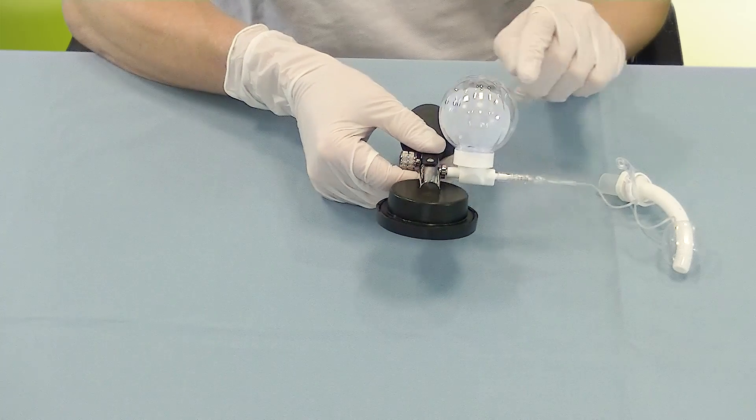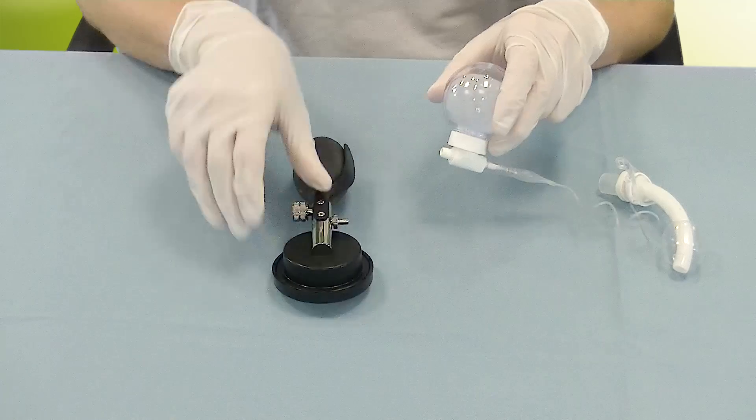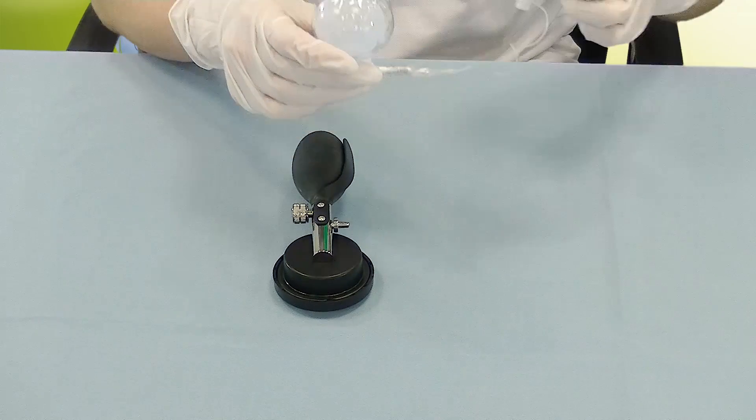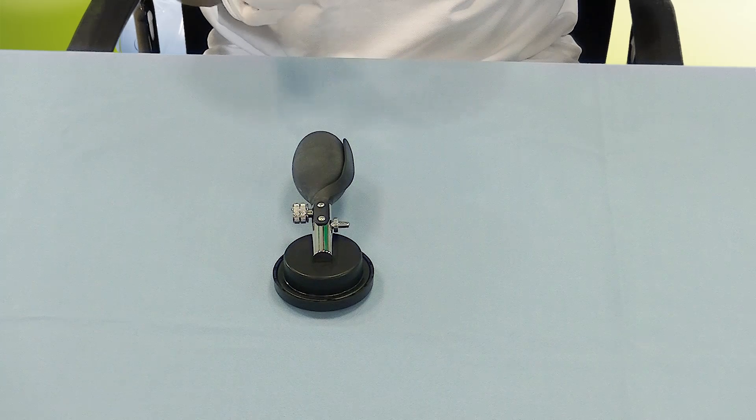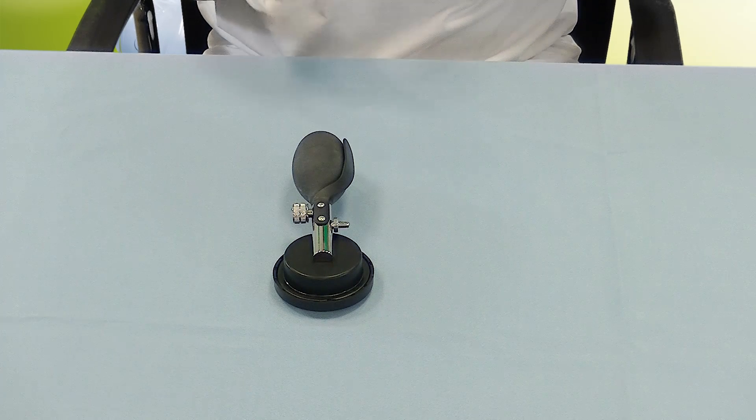The inflated blue balloon allows for an unprecedented visual of the cuff as it is in the patient's trachea, and also confirms that the cuff pressure is within range.